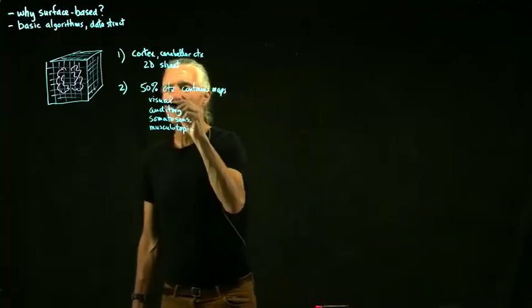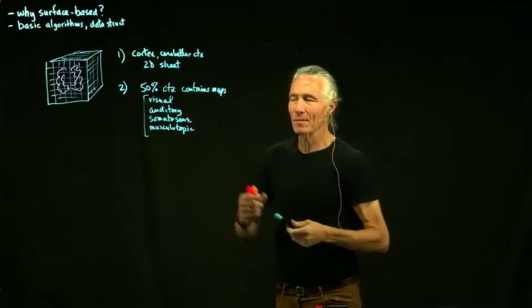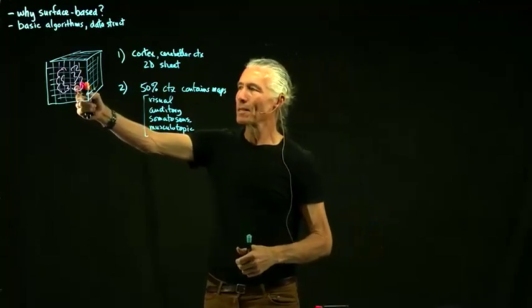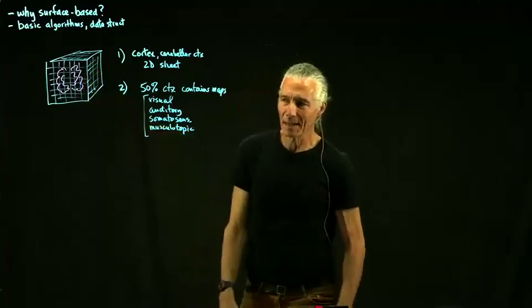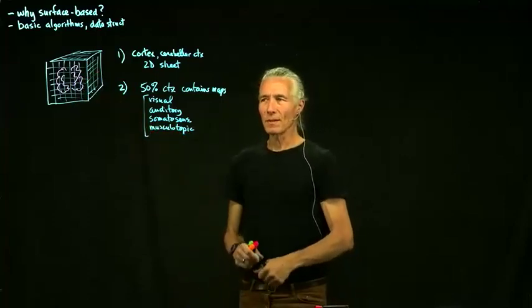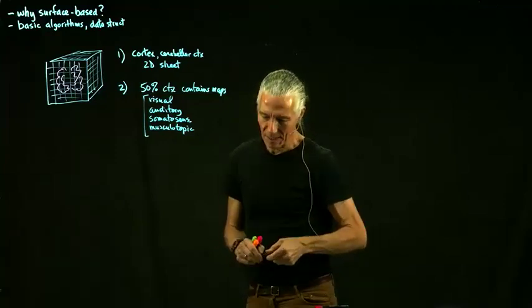So that's a good chunk of the brain. And when you're analyzing maps as they go around the little folds of the cortex, it's obviously a lot easier to view these maps on the surface.